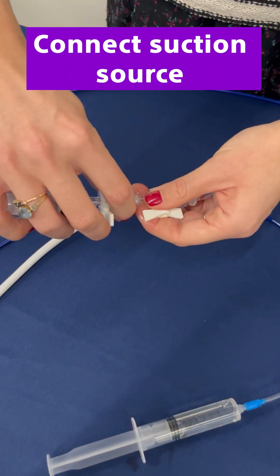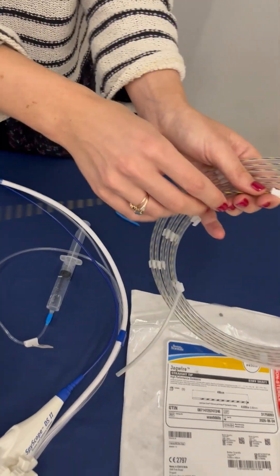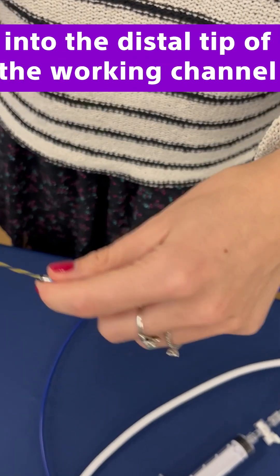If desired, connect the suction source. If you're using a guide wire approach, first wet it and backload the guide wire into the distal tip of the working channel.